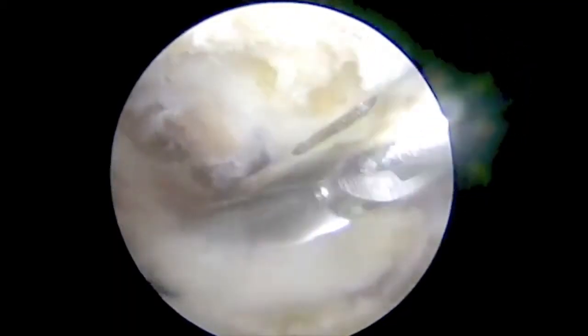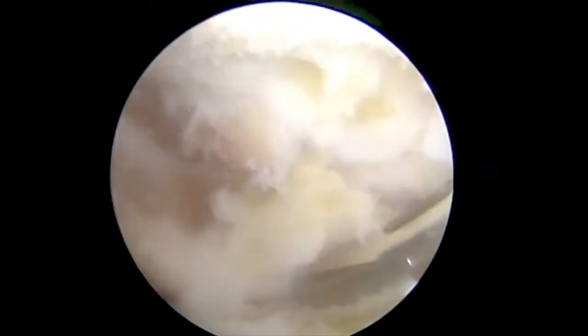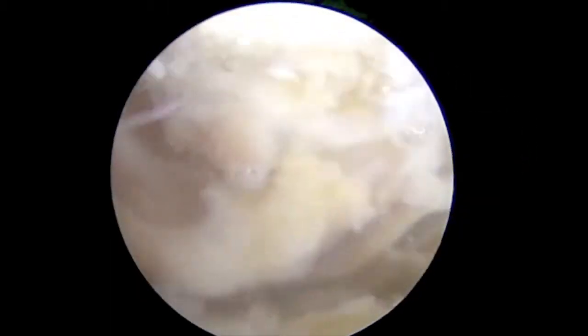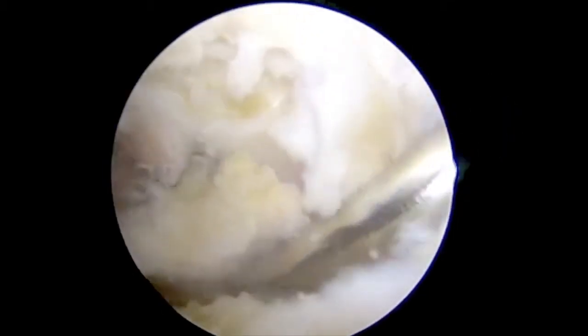To begin, the lesser tuberosity footprint is prepared using an arthroscopic oval burr. To obtain adequate anterior access, forward flex the arm and place it in 10-20 degrees of internal rotation.